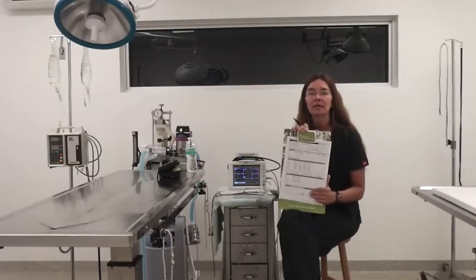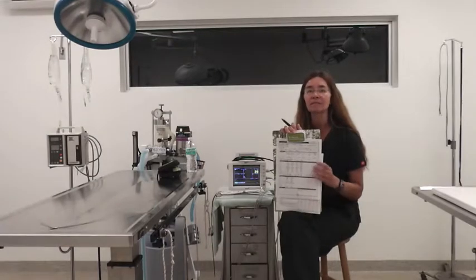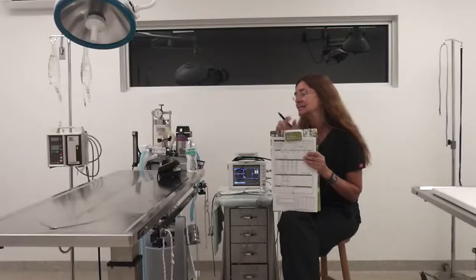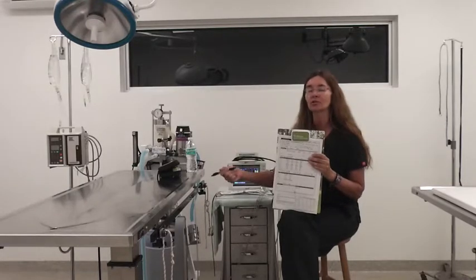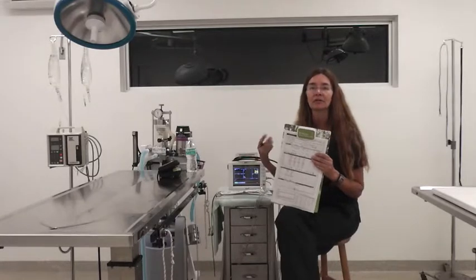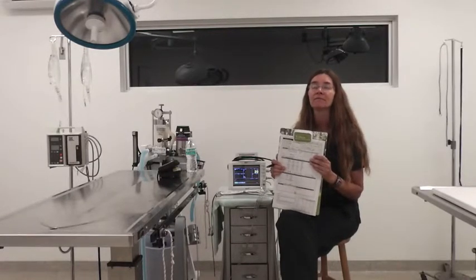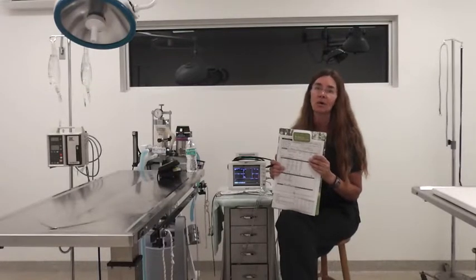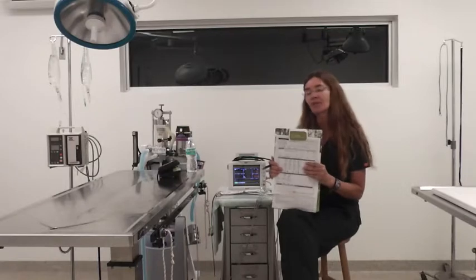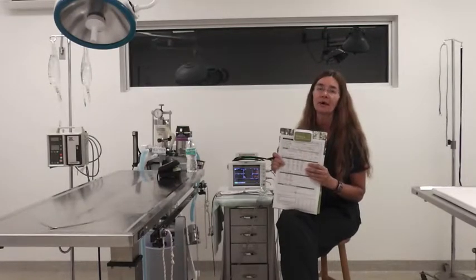This is why doing an anesthetic chart, monitoring every 5 minutes, is very important. Other than every 5 minutes, make sure you have a stethoscope on, listening to heart rates, just watching everything. Don't ever let your attention wander when you're in surgery. Things can go bad very quickly, and you just don't want that. Very important: stay alert, stay with it, monitor constantly, hands on patients, and everything will go great.